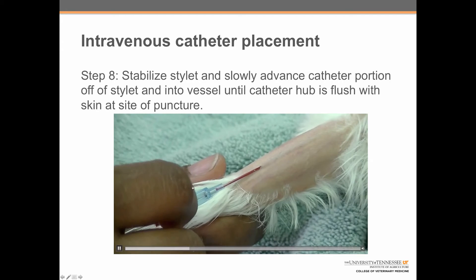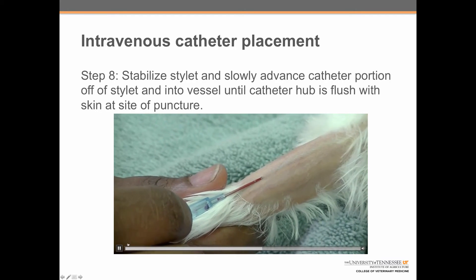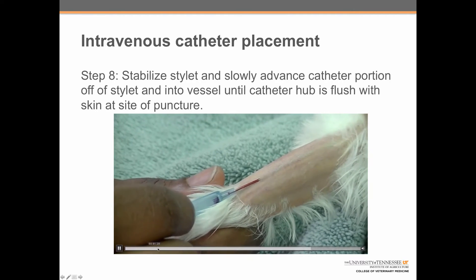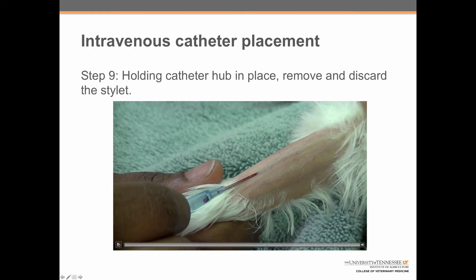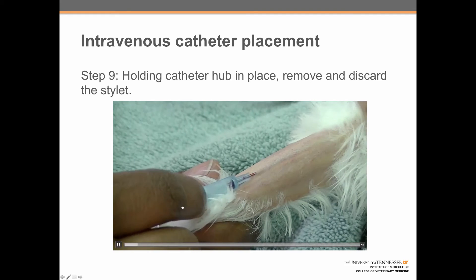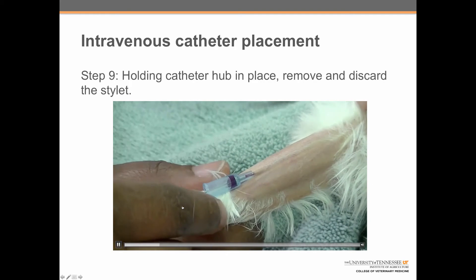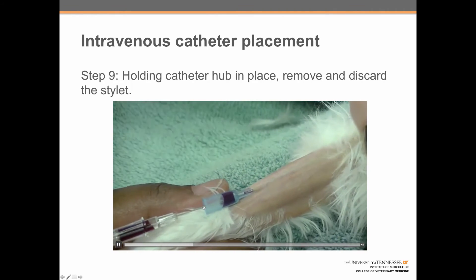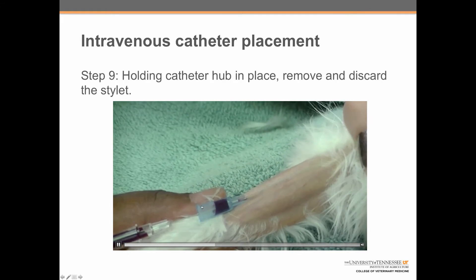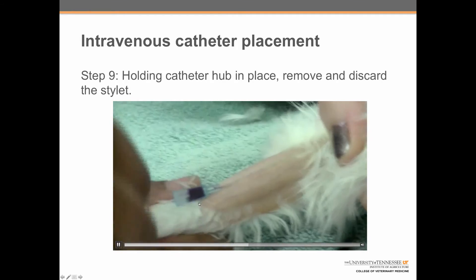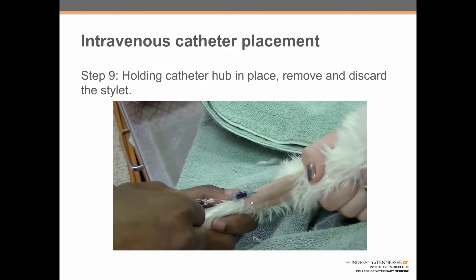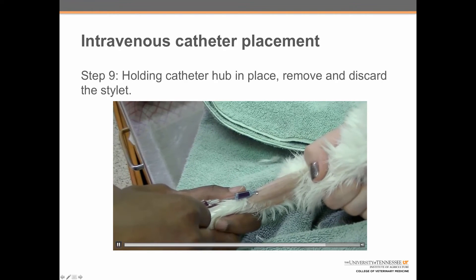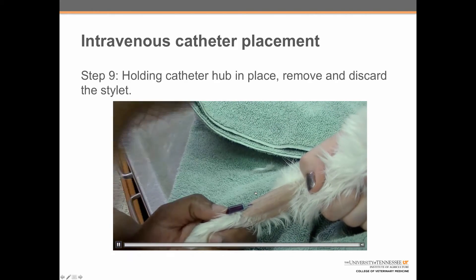At that point she stabilizes the stylet and slowly advances the catheter portion off of the stylet and into the vessel until the hub is flush with the skin at the site of puncture. She does this with the tip of her index finger while the rest of her hand holds the catheter unit stable. Holding the rest of the stylet stabilized with her thumb and ring finger, she uses her index finger to advance the catheter until the hub is flush with the skin, then gently removes the stylet and discards it, using her thumb to keep the catheter stable so it does not come out.